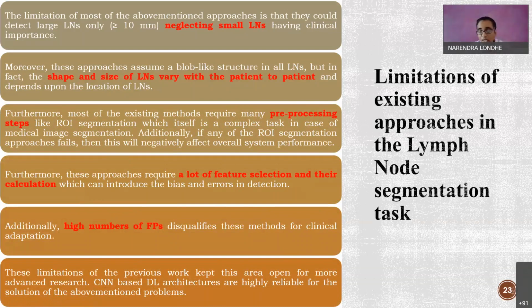First, I would like to tell you that when you are doing the segmentation of the lymph nodes, there are some limitations. See, unless you understand the problem challenges, you cannot improvise on your technology. Okay, you cannot improvise on your CADx system. That's why every time, you first find out what are the limitations of the existing methodologies.